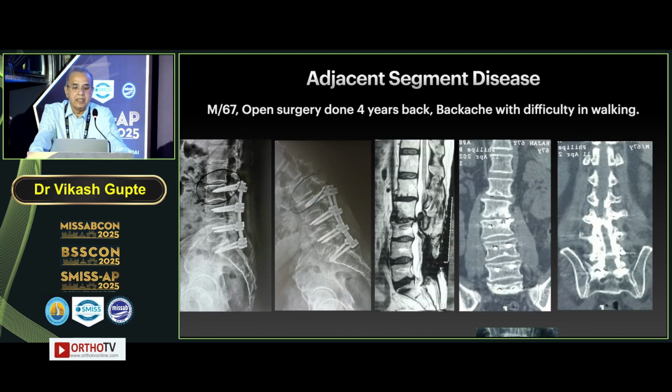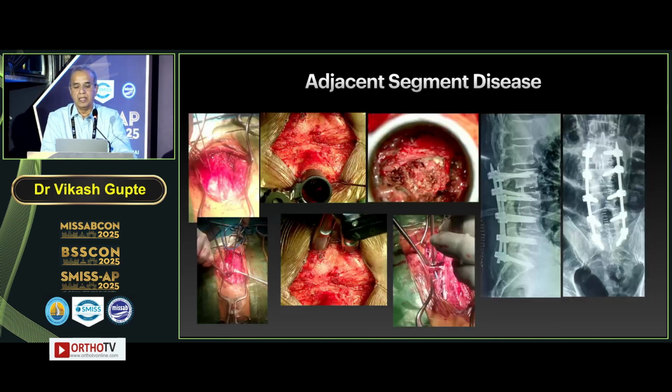Adjacent segment disease, now this is a tricky thing. This patient was operated on with open surgery, pedicle screw fixation, and decompression, and comes with an instability at the adjacent segment. And he is insisting on minimally invasive surgery. Now how do we do it? This is the technique we have developed.